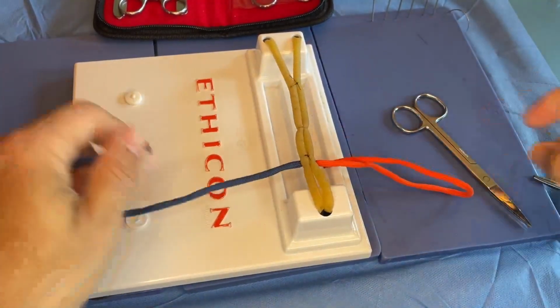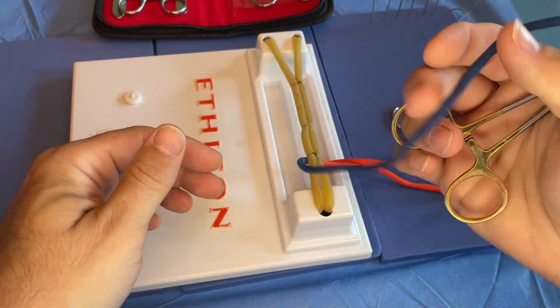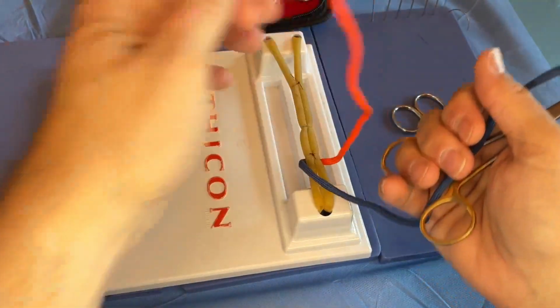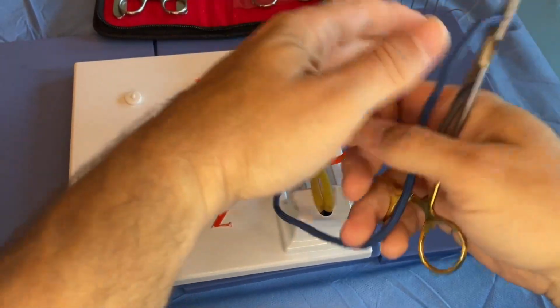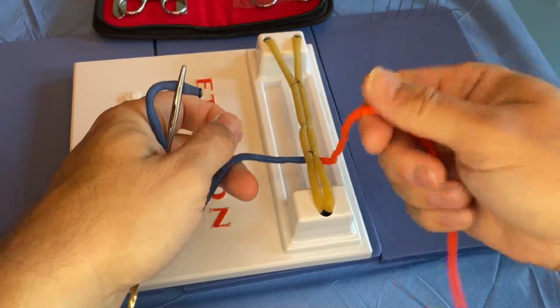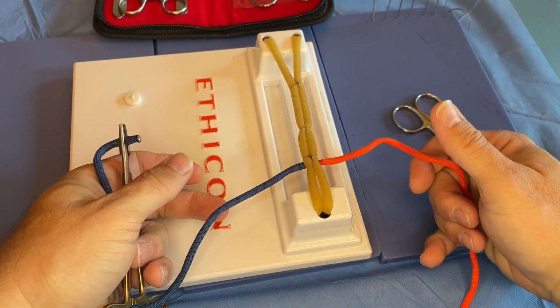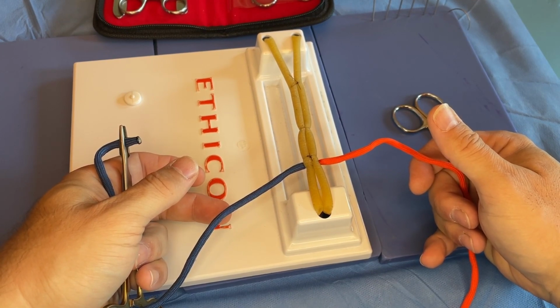So instead of pretending that we've got a needle here, some people will hold the needle driver in their right hand and grab the free tie, so they've got a loop, and then they'll tie with their left hand. That's perfectly acceptable. I hold it here in my left hand and tie, so to speak, with my right. That's fine as well. It's really just whatever you can do that will lay down square knots that are consistent.